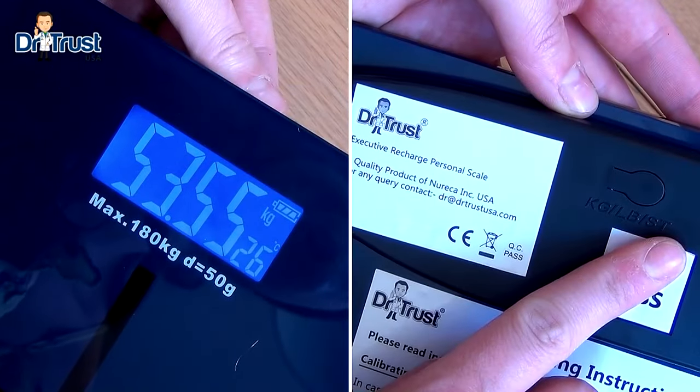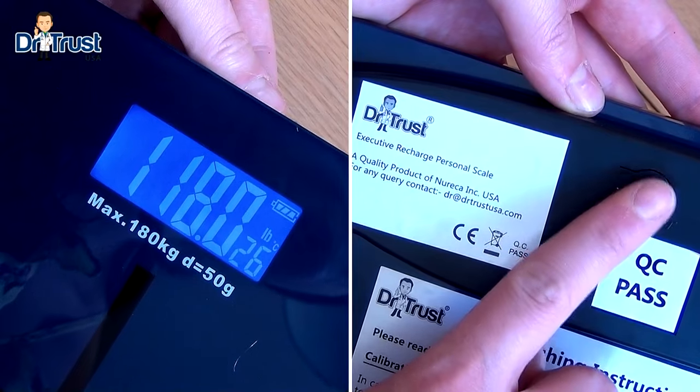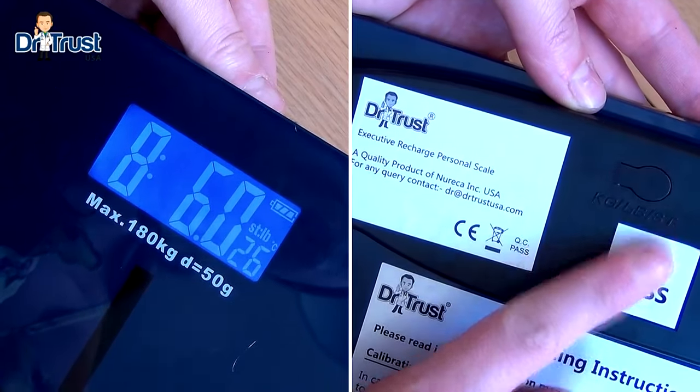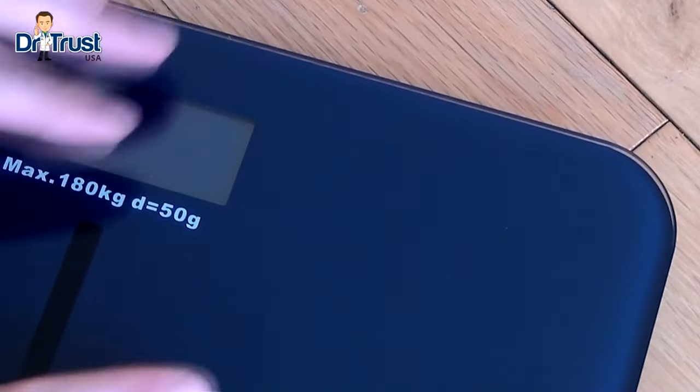The measurements can be displayed in kilograms, pounds, or stones and pounds by cycling through the options using the button on the back of the scale. We've also included anti-slip feet for added safety and protection on any surface.